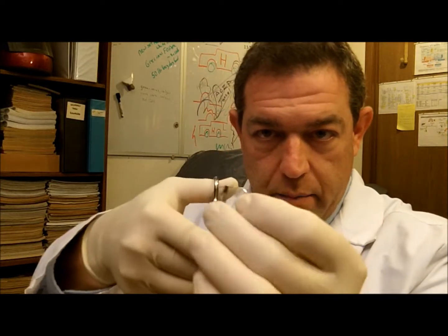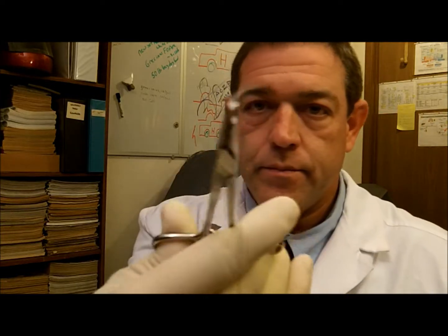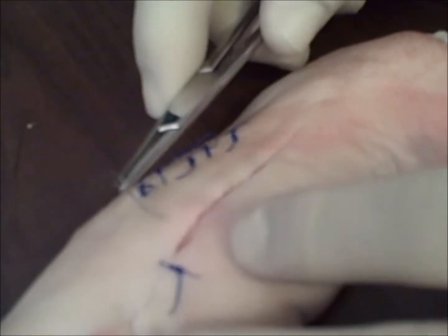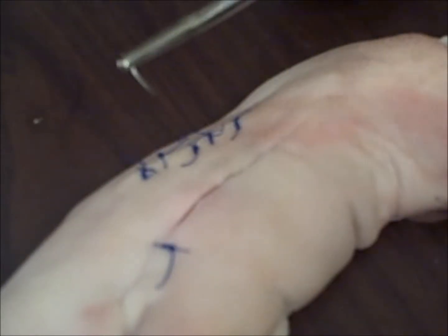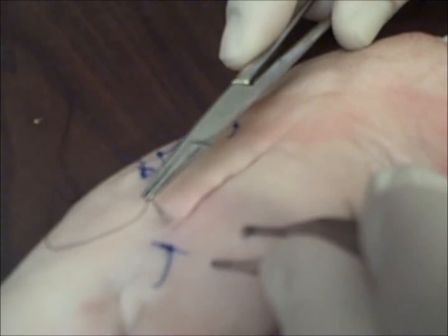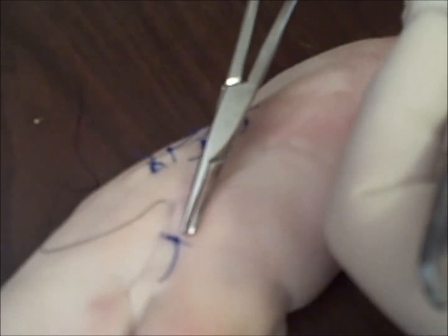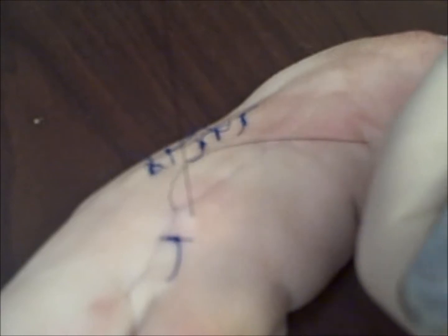We're going to start by clamping down on the needle away from the tip, secure it like so, and then start our suturing. Here we have the pig's foot with the wound that we inflicted, and we're just going to go about 2 millimeters to the side of the wound. There we go, so we've got that pushed through. Fresh thread, so it's pretty long — let a little bit hang out there.